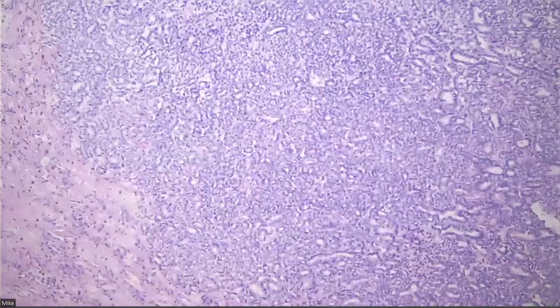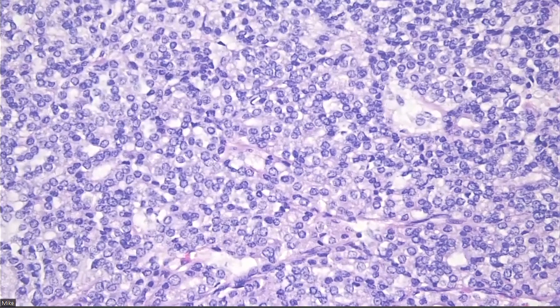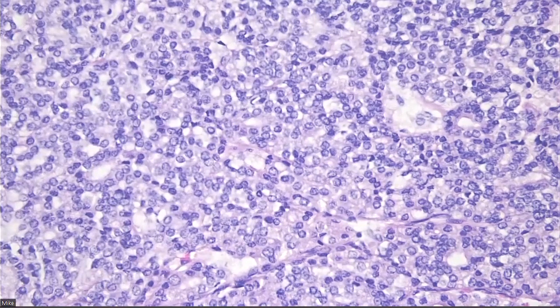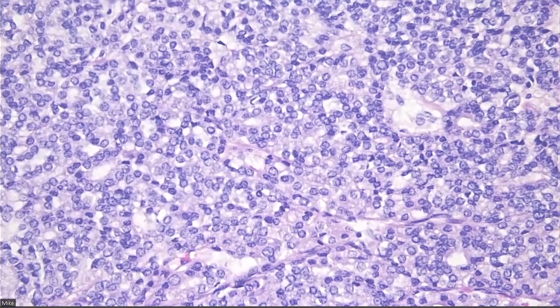So in order to be called poorly diff, you need compressed solid growth, where you walk through a bunch of cells without coming across stroma or colloid. Yeah, there's one follicle here and one follicle there, but you can walk through a pile of cells without encountering any other structure. You are solid or insular or trabecular. So to be poorly diff, you have to have that. And then you also have to have what? Necrosis or mitosis.